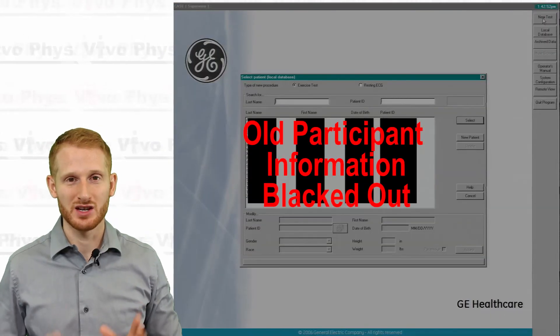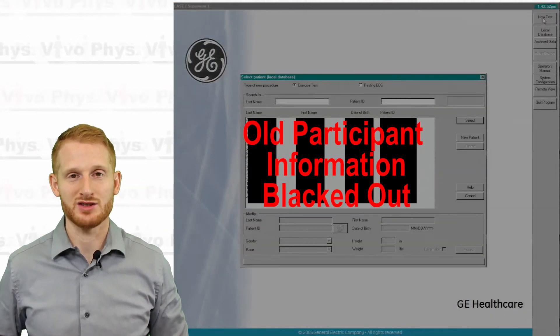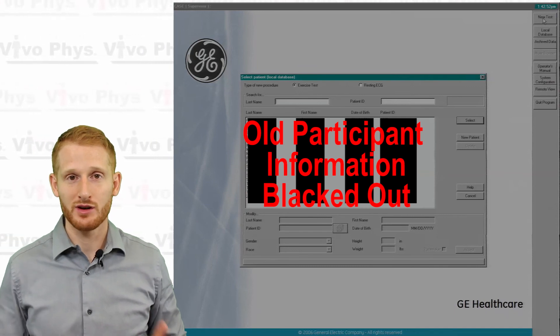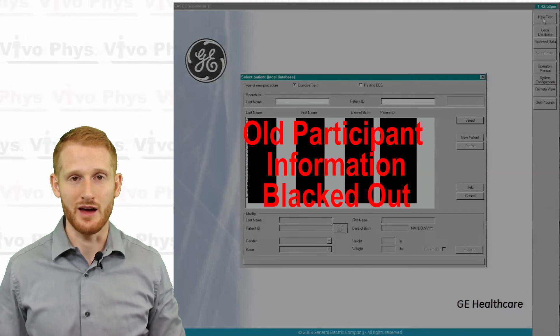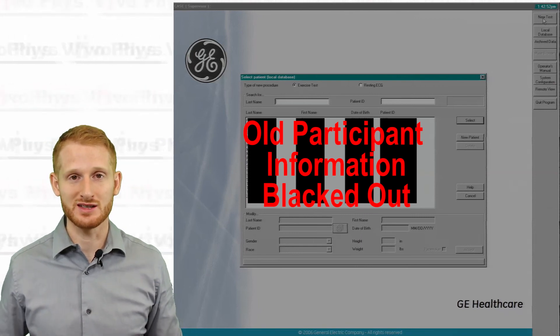Simply click on new test. It's going to bring up a pop-up window asking you who the participant is. If they're already in your system, you can just search for them and open them up, so just double click on them, and that will sort of go into the testing mode.